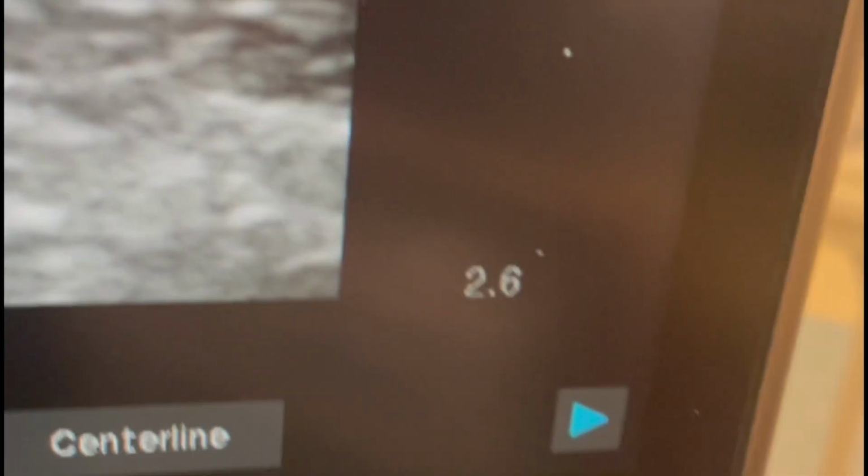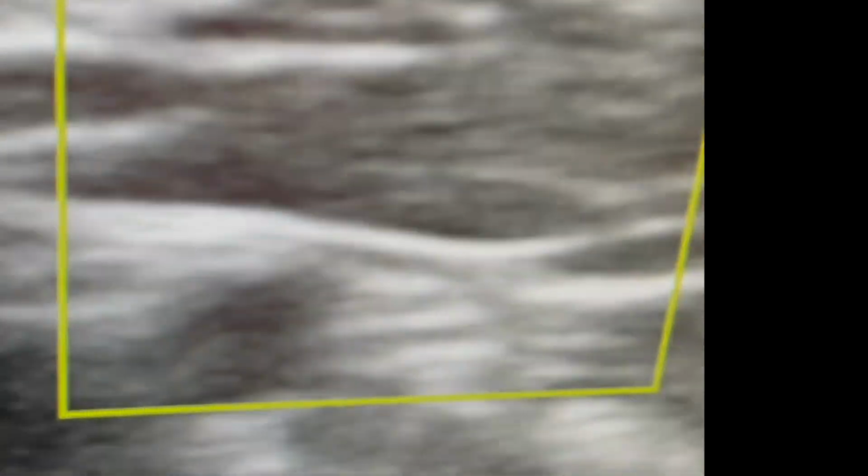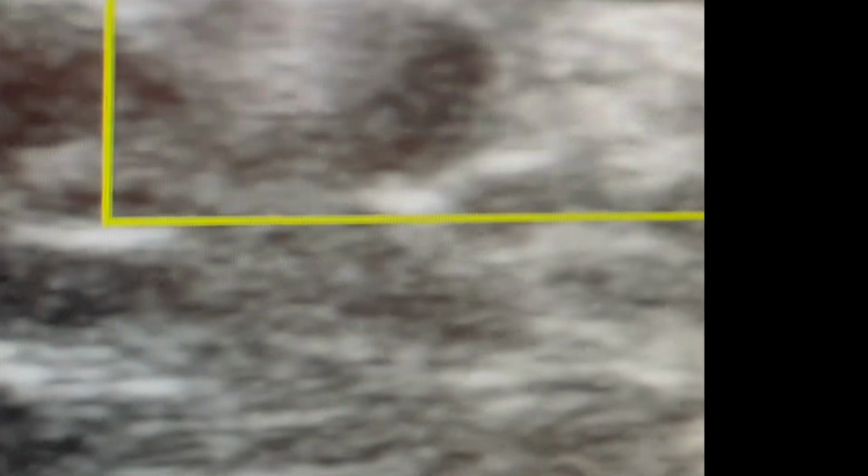Further down, we don't see any vessels, except for right there. So you want to identify any vascular structures. Sometimes vascular structures can look like an abscess. So over here you can use the color Doppler and see if you have any vascularity over that area of interest before you start cutting. So this one certainly does, so we would not cut into that area.